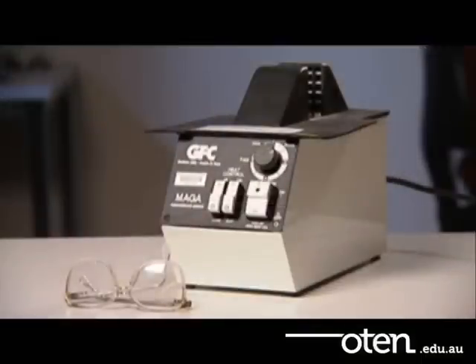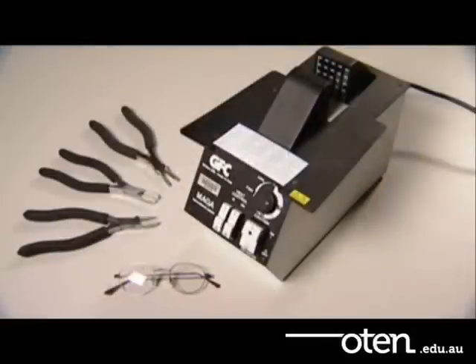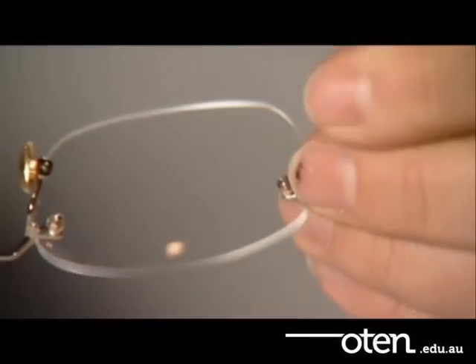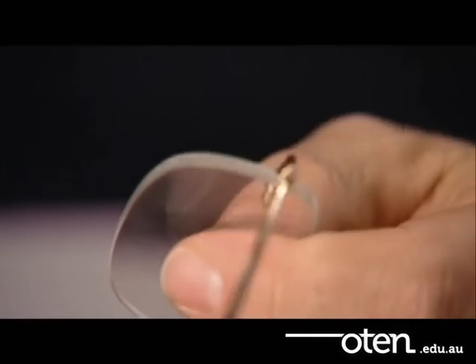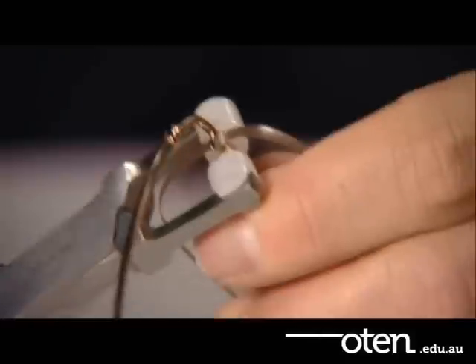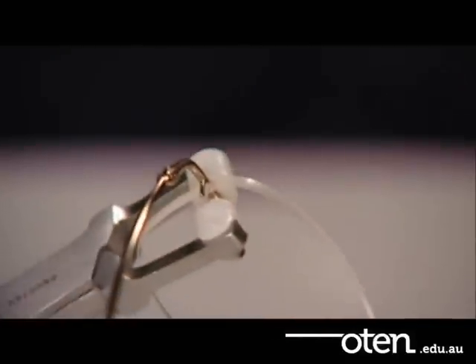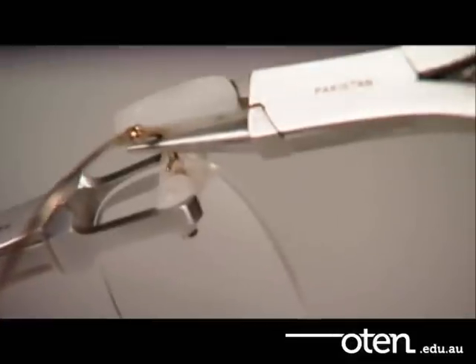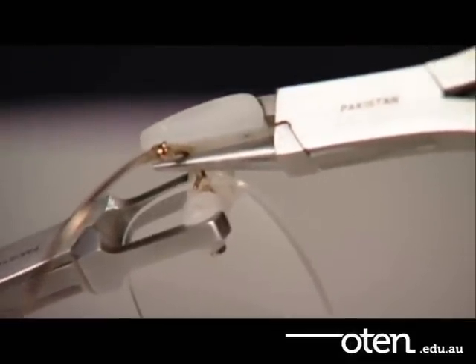When adjusting plastic frames you will mainly use frame heaters. When adjusting metal frames you will mainly use the appropriate set of pliers and occasionally frame heaters. Take special care when adjusting rimless frames. Use special rimless pliers to support the lenses and their plugs and to reduce the strain on these during the adjustment. The rest of the steps that follow are the same for adjusting all frame types. Only the tools used will differ.